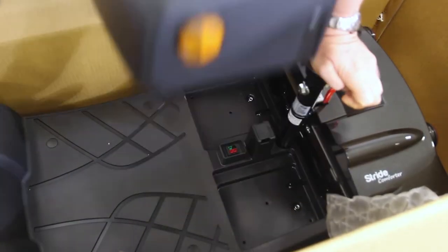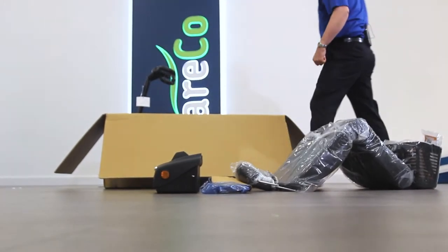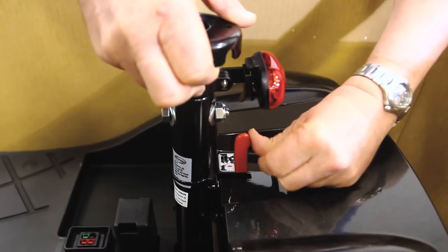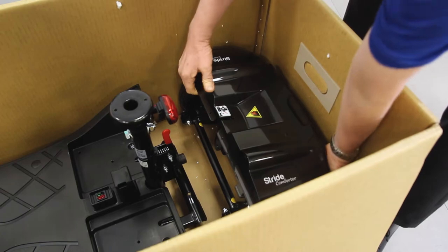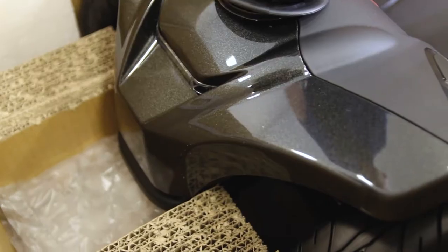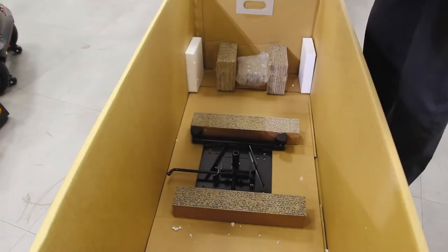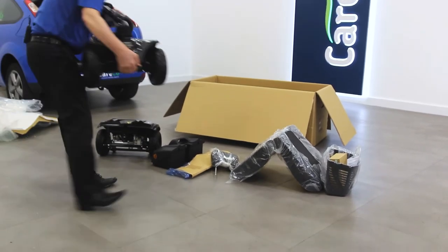With one hand placed firmly on the seat post, lift off the battery by the handle and set it aside. Now you can split the front and rear sections. Push the red handle behind the seat post to unlock the sections, then pull them apart. You can now lift out the rear section separately, followed by the front section. This makes the weight of the product much more manageable. Don't attempt to lift the scooter out as a whole as it is quite heavy.